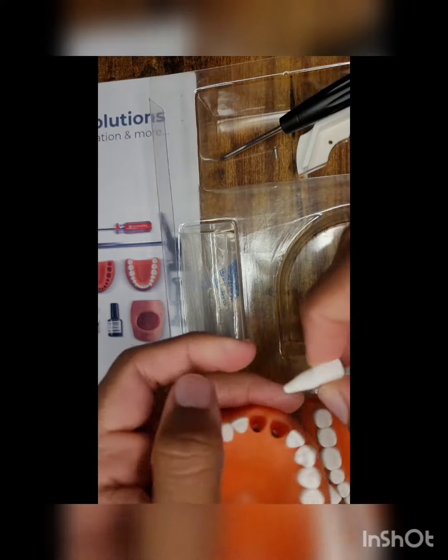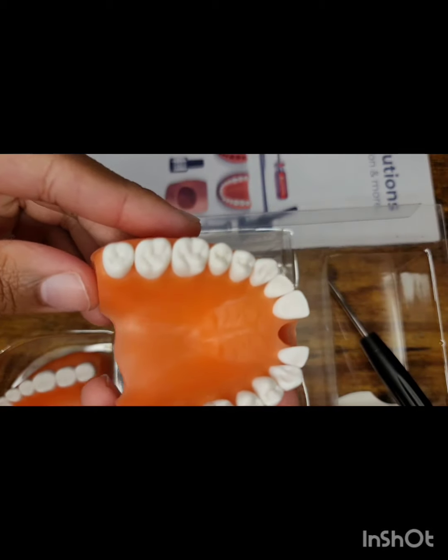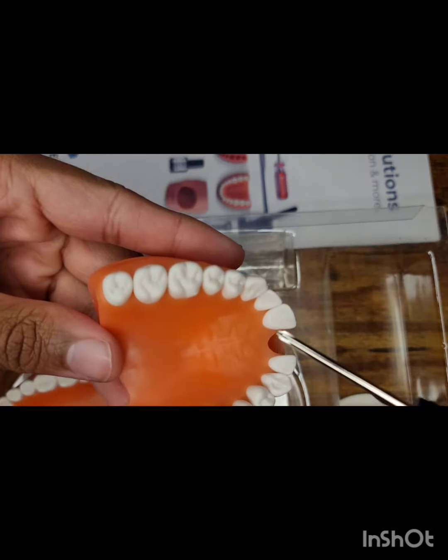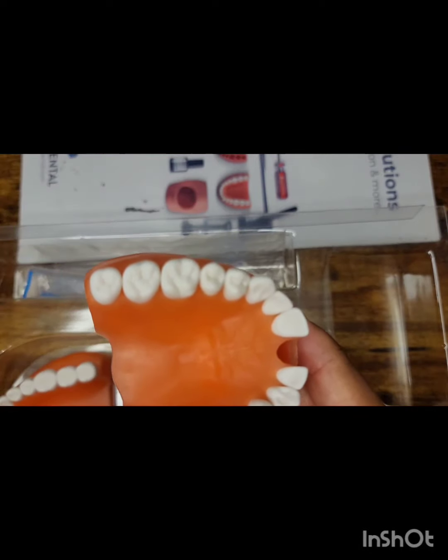If you'd like a video of how it applies to the tooth, feel free to leave that in the comments and I'll make another video showing that application. Just to let you know, it can stain the gingiva a little bit — it's similar to calculus. But you can remove that with the air-water syringe. Just go ahead and blast it with both air and water and it should come out.